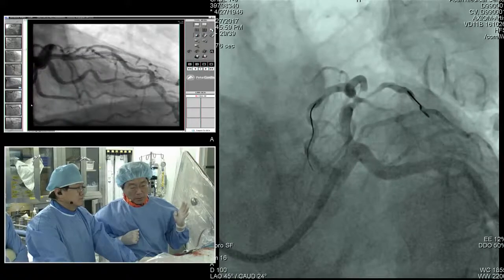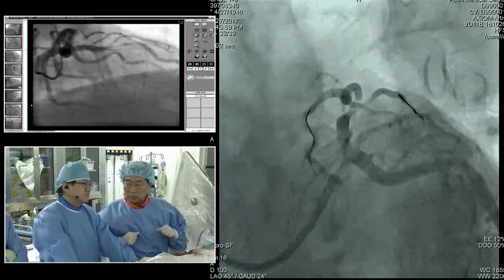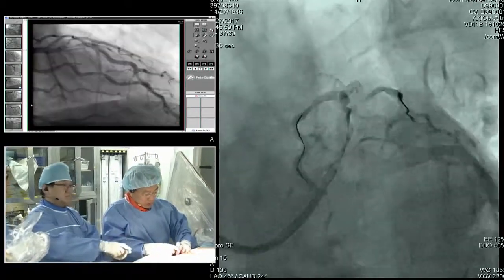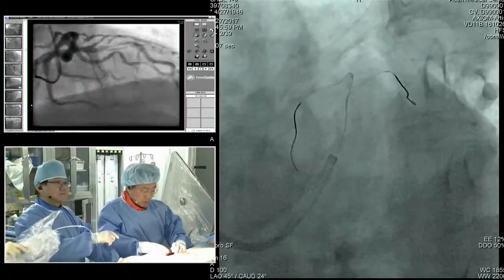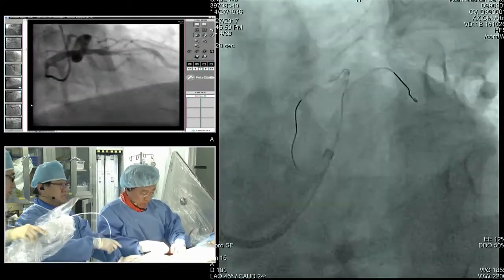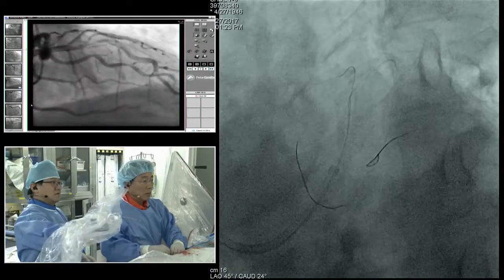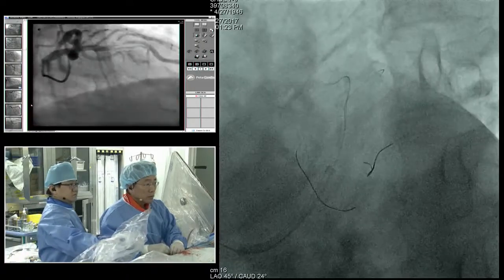To be honest, before the IVUS, we're going to do the balloon dilation first. However, I want to show what's happened. I believe that. And so this is IVUS. Okay. Different. So diagonal branch first. So these pictures, already did a balloon dilatation with simultaneous kissing? No, not yet. Yeah, this is very fresh, no touches.